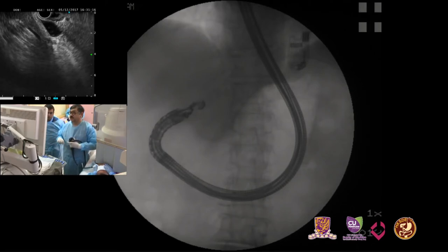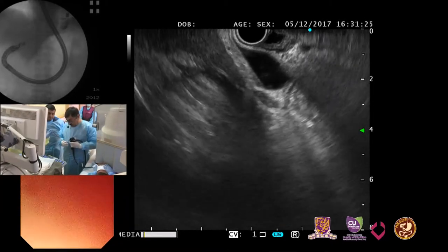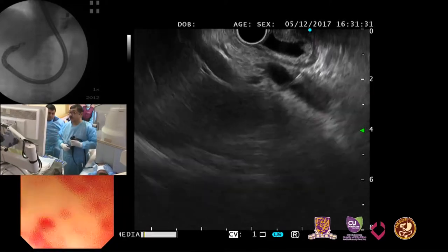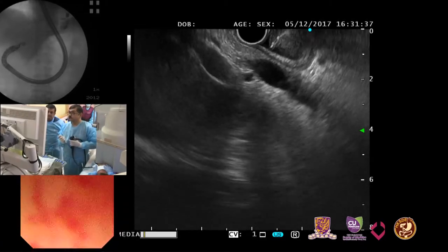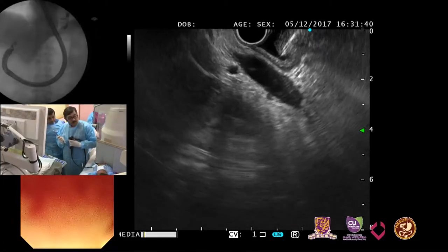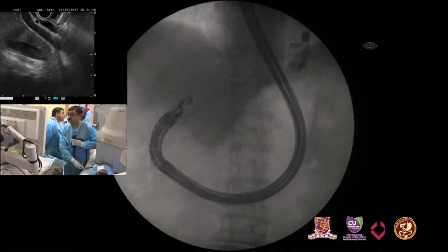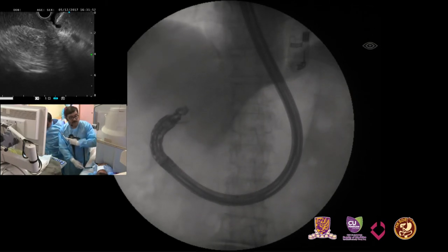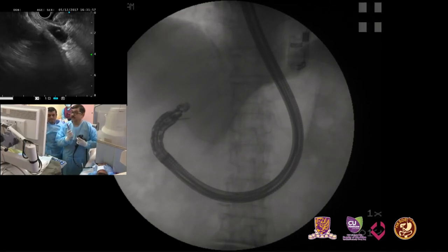So the bile duct should be like this. I will not puncture, I'll just show you the direction of the needle. And then you need somebody to expertly negotiate the wire. So is the needle out? Fluoro? Now see, this is my needle position. Here. This is a much better position. If I further change it so that you start looking down. Okay? So this is one tip.